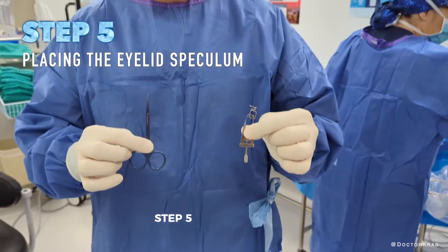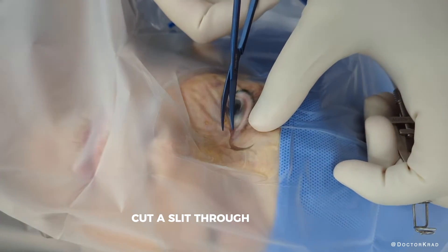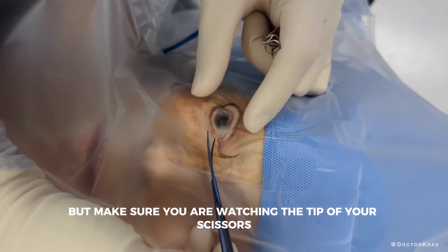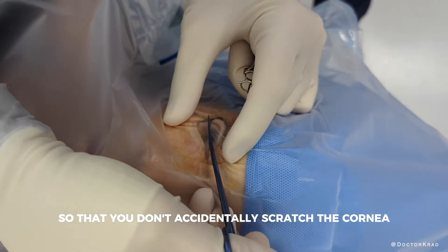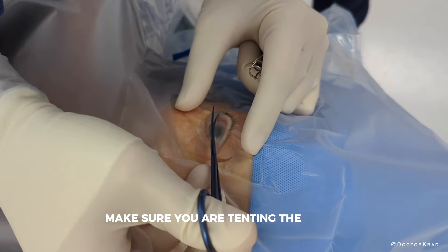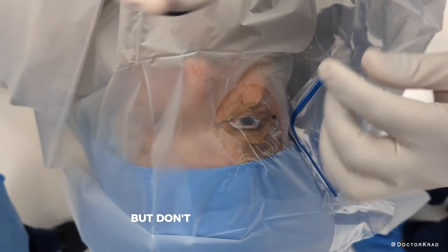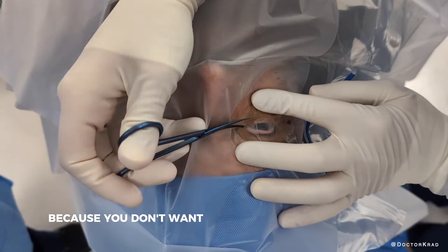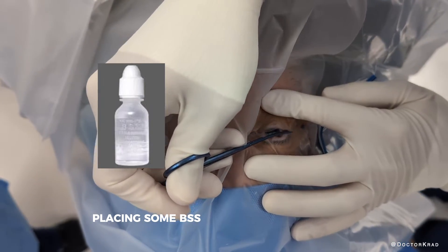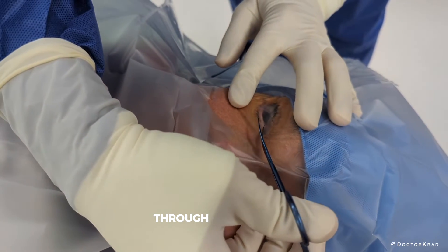Step five: grab the drape scissors and eyelid speculum. Cut a slit through the drape, but make sure you are watching the tip of your scissors so that you don't accidentally scratch the cornea. When you are over the cornea, make sure you are tenting the drape up and away from the cornea so that you don't accidentally scratch it. But don't tent it up too much, because you don't want to remove the adhesive drape from the eyelid skin. Placing some BSS within the slit can help protect the cornea and it also helps the scissors glide through the adhesive.